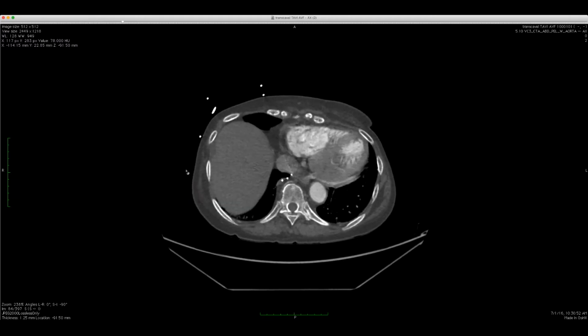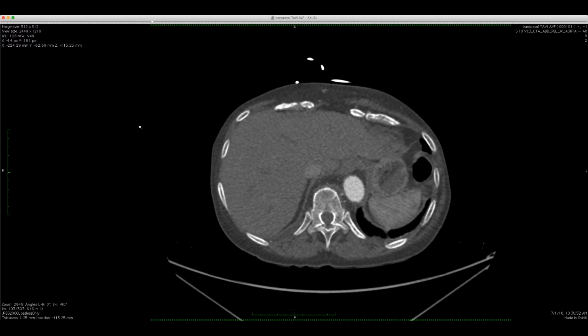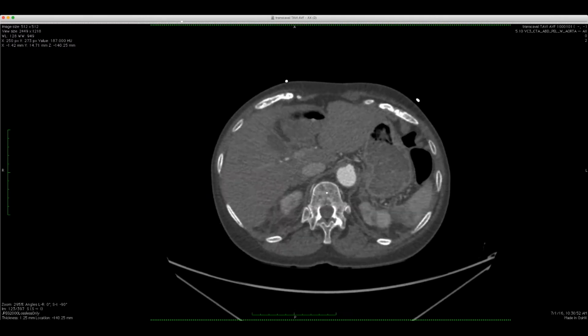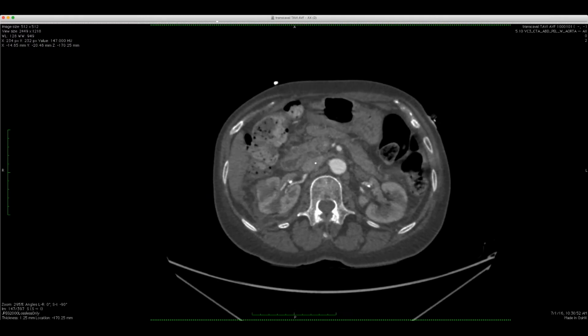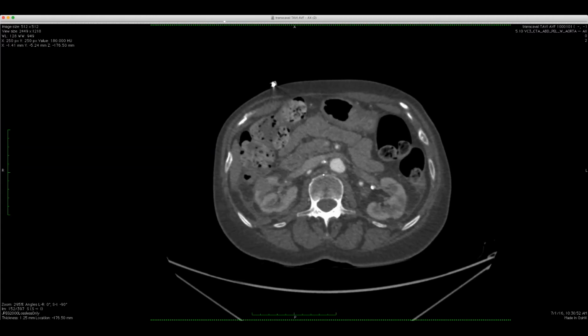The surgeons here have gotten quite good at doing a transcaval approach. They go in the IVC and take a series of lassos and snares and poke into the descending aorta and then come up retrograde and do the valve retrograde.